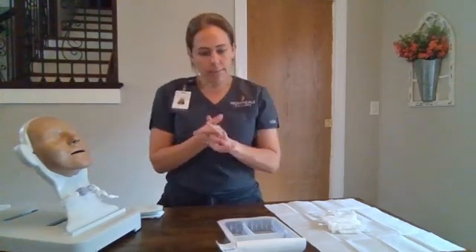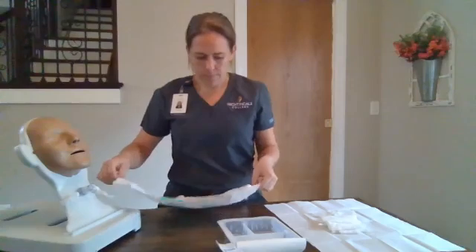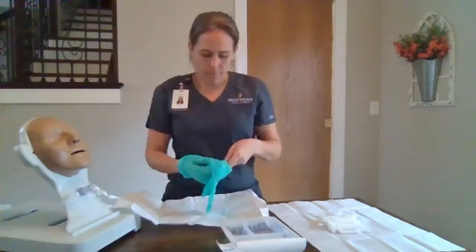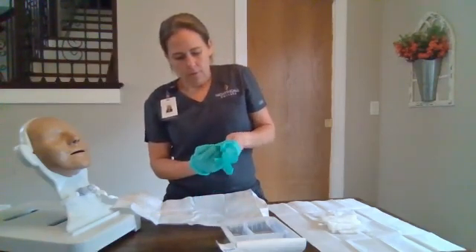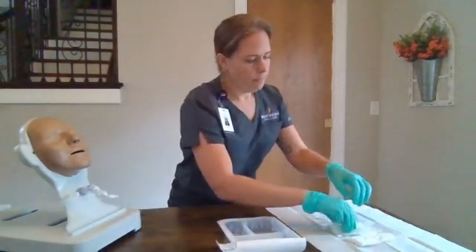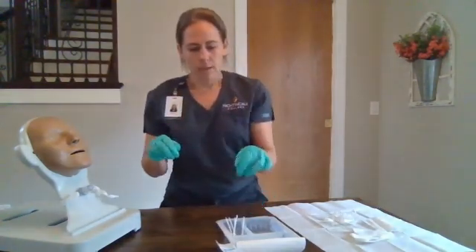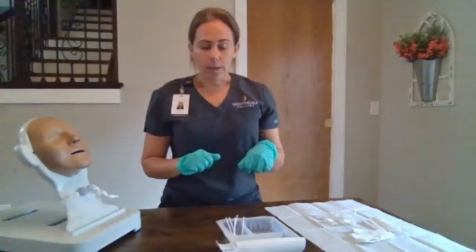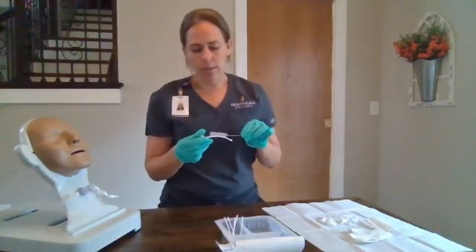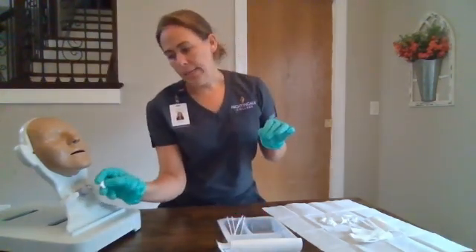We're going to perform our hand hygiene and place our sterile gloves. We'll organize our supplies and place our cleaning swabs in our saline. We're going to clean our inner cannula — we'll take our brush and clean inside and out until there are no more secretions. Discard our brush, rinse our cannula, replace it, and lock it in place.